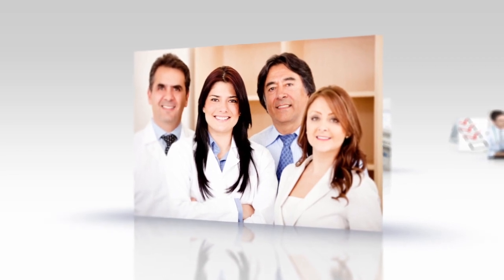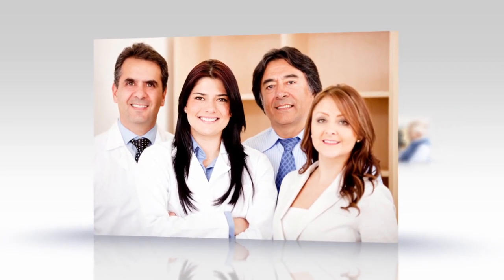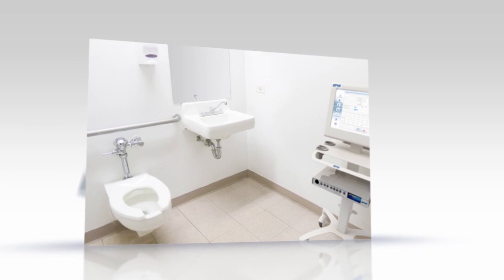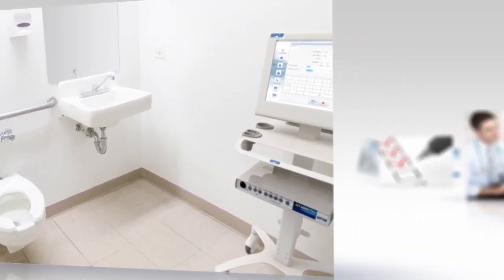Running the UroCuff test is simple and can be performed by any clinical staff member. Although the instrument can be located in any room, we recommend it be located in the bathroom closest to the reception area, as it also performs stand-alone uroflows.